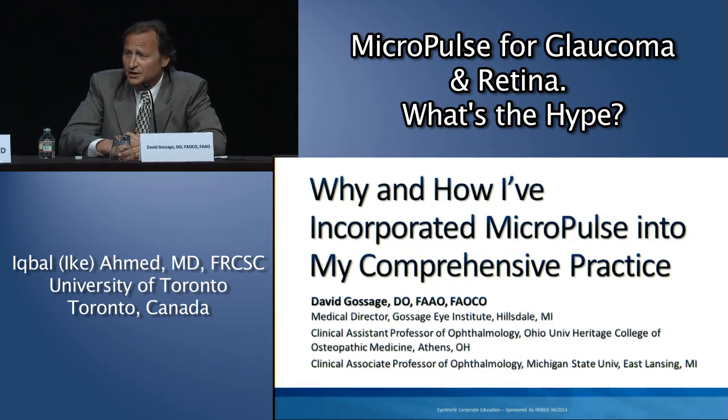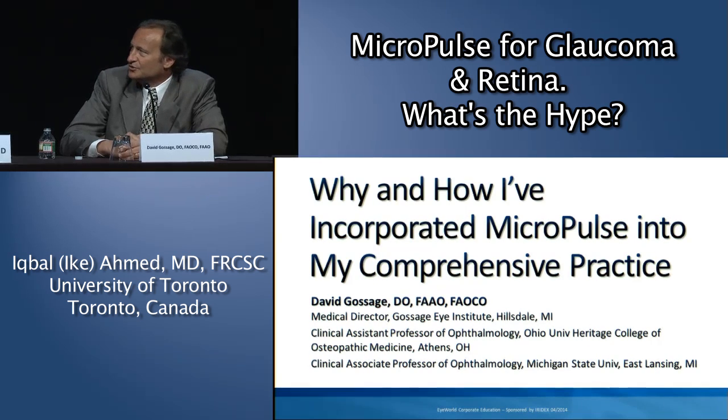The other thing, too, is cost. The cost of medications is obviously expensive. Being on multiple medications, you always have the issues of corneal toxicity and other issues that come into play and systemic side effects. So from my standpoint, with patients who are already on multiple medications to begin with and having to also put another medication in their eye to treat their glaucoma, to them it's a lot easier just to have a laser and say, okay, I'm done.